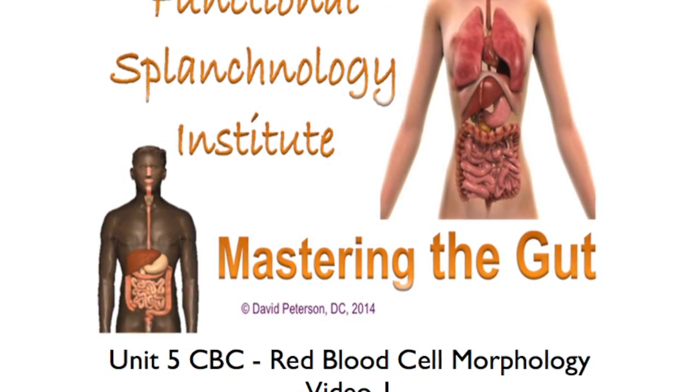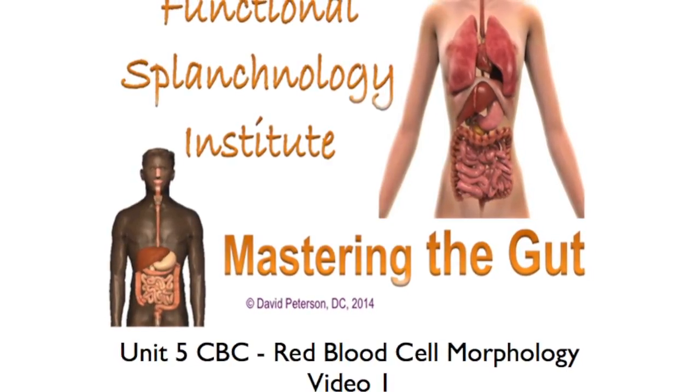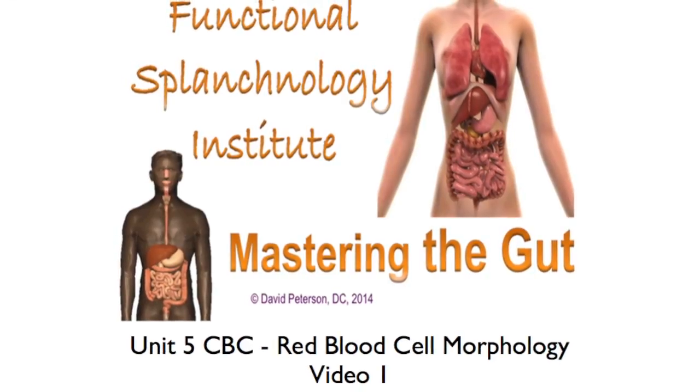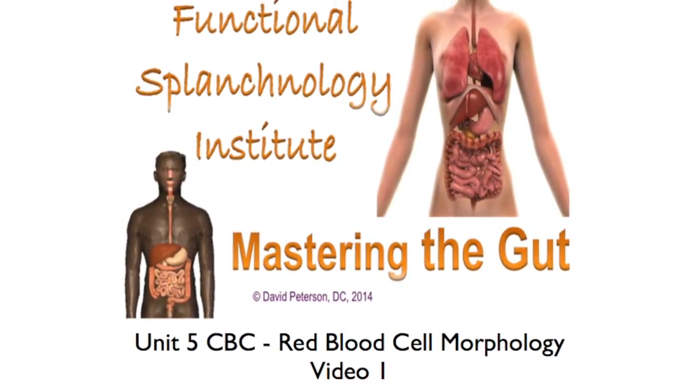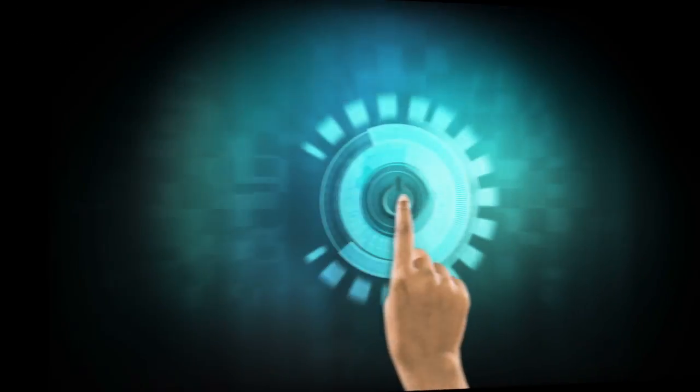For the purpose of this module, peripheral blood smears are the recommended method of determining red blood cell morphology. Live blood cell analysis is another method, using dark field or phase contrast, that can identify red blood cell morphology.